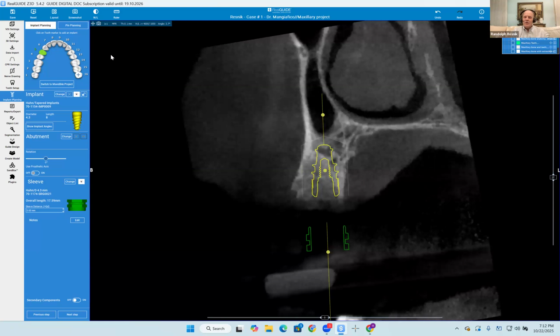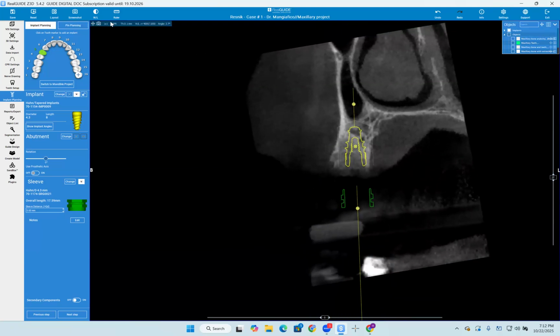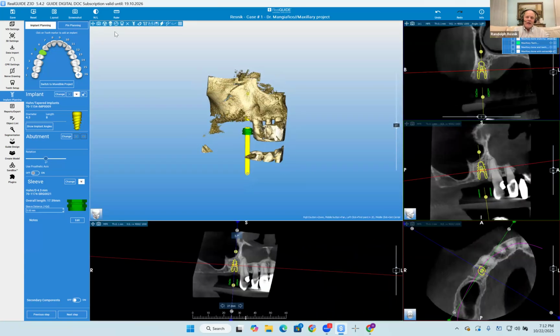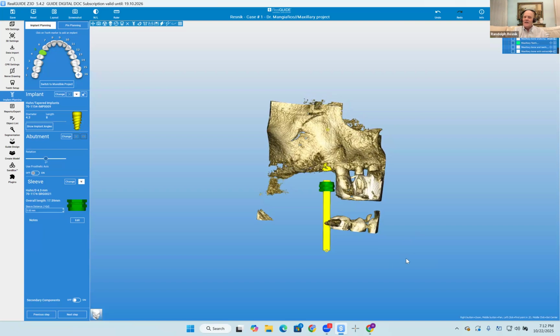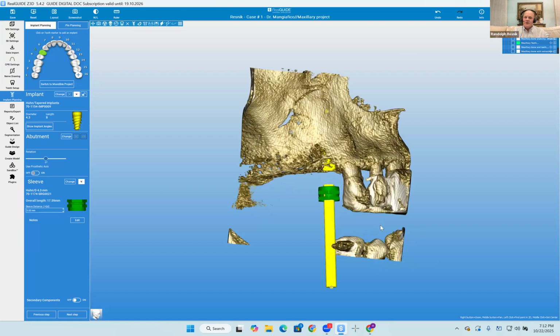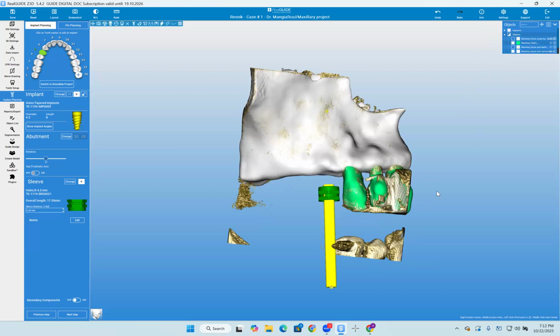Could I ask you one thing though? What's opposing on this? It's not a good looking molar. Okay. So is there any reason that you're only replacing to the bicuspid? No molars? Yeah, just because the molar didn't look fantastic under it. I do believe there's a premolar under it, and the molar right behind the opposing didn't look great. So I felt like she might be losing that soon.